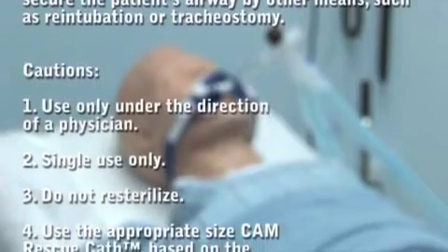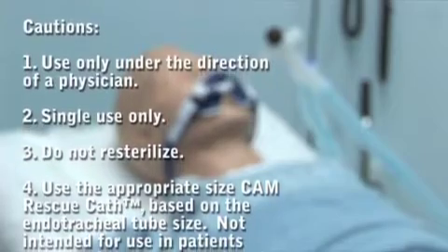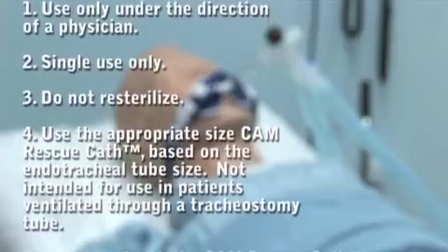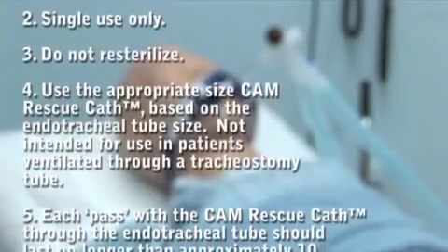During use of the CAM Rescue Cath, always stabilize the endotracheal tube with one hand to prevent its dislodgement, and be prepared to secure the patient's airway by other means such as re-intubation or tracheostomy. Use only under the direction of a physician.